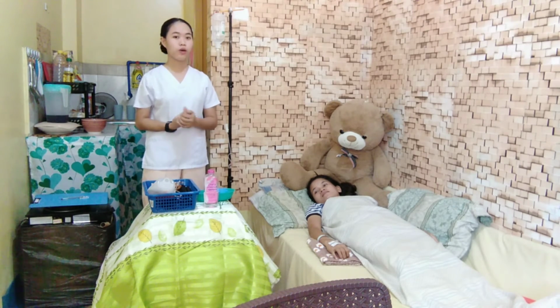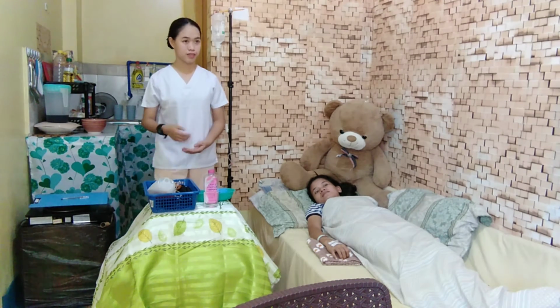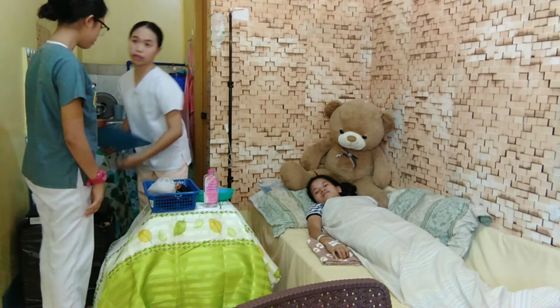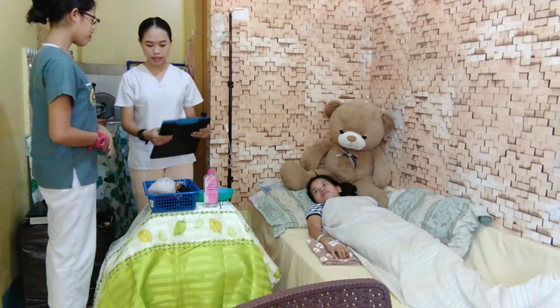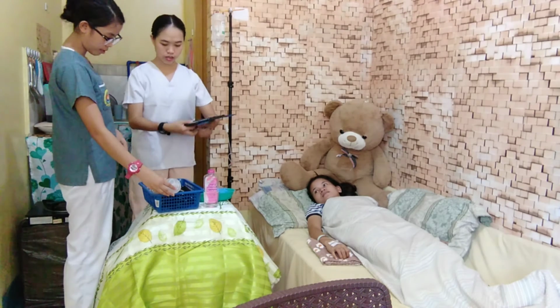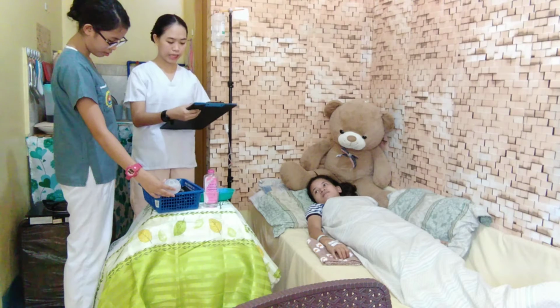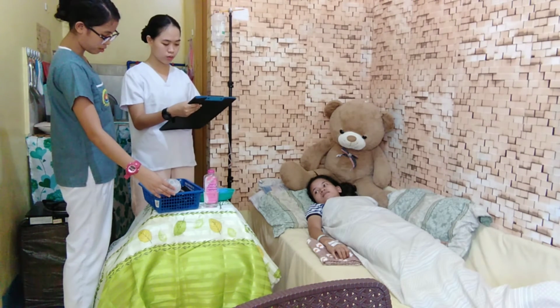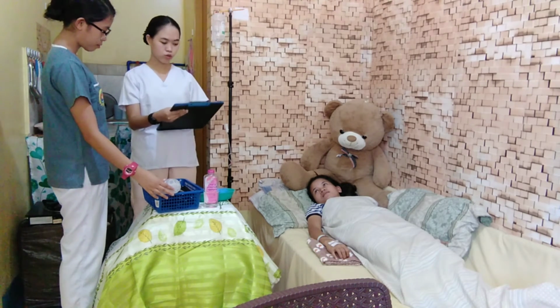So I will ask my assistant, my licensed nurse. Ma'am, we will administer blood for the patient named Miss Mariam Lyrene Dumis. Ma'am, have you checked it? Yes, Mariam Lyrene Dumis, and the blood type is AB+. Yes, the hospital number is 0011 0123. Yes.